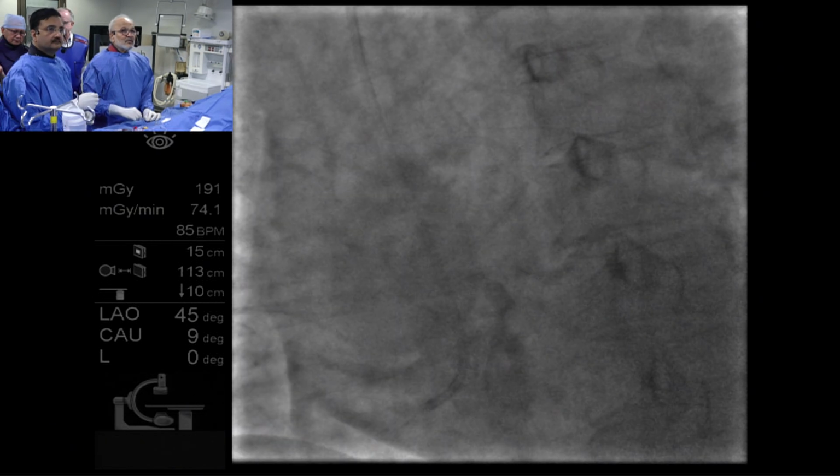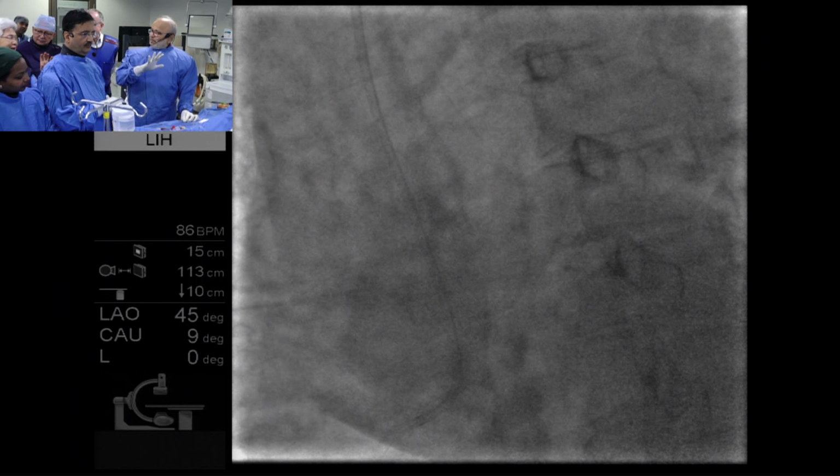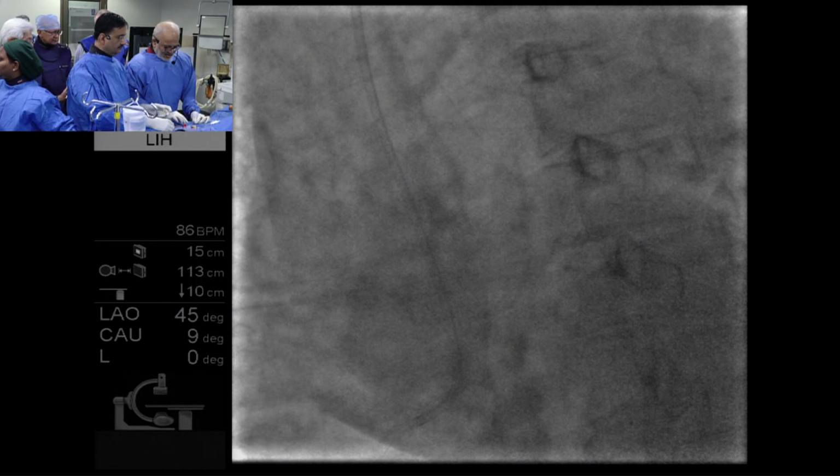I try to change my mind, right? Proximal should be okay, but the distal, we need a pre-dilatation. Yeah, right, but we are seeing proximal first. Okay. Yeah, let us see.